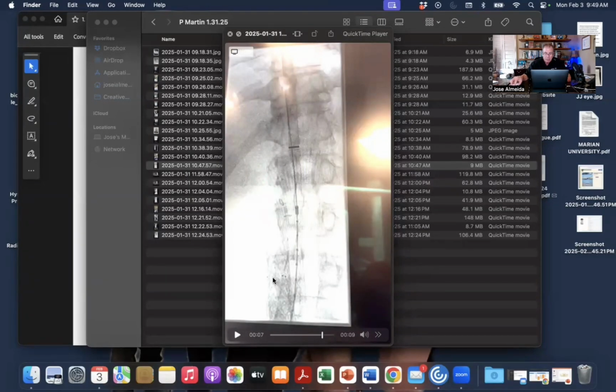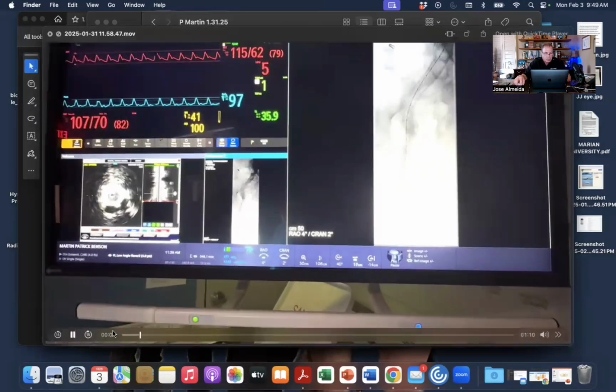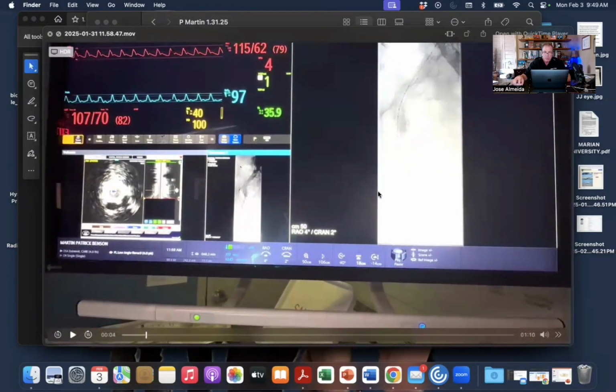These are bilateral stents. We are up on one with IVUS, and we're looking at the funnel with IVUS as it was deployed. So where are we at this point? We were able to cross the right side easily. The right side wasn't even really completely occluded. A lot of stenoses. The wire went up easily with IVUS here.